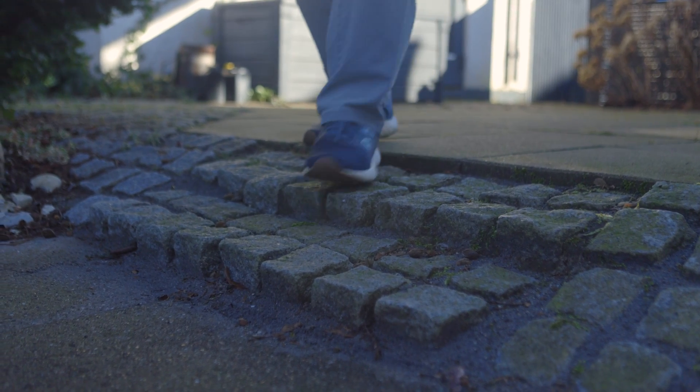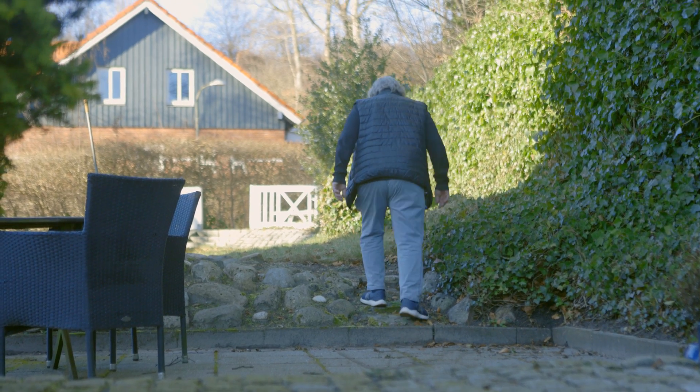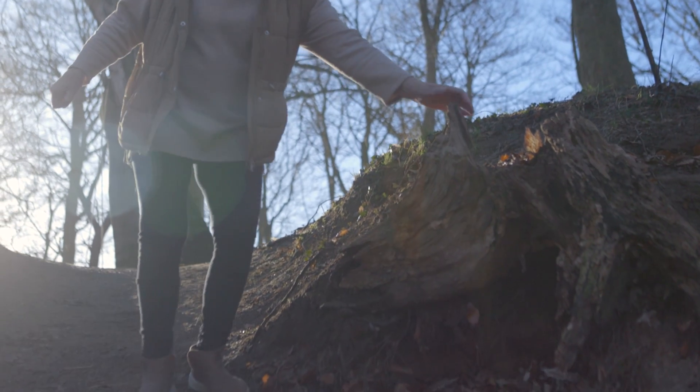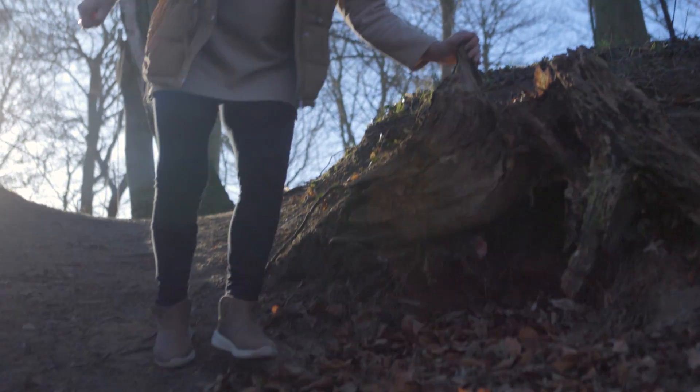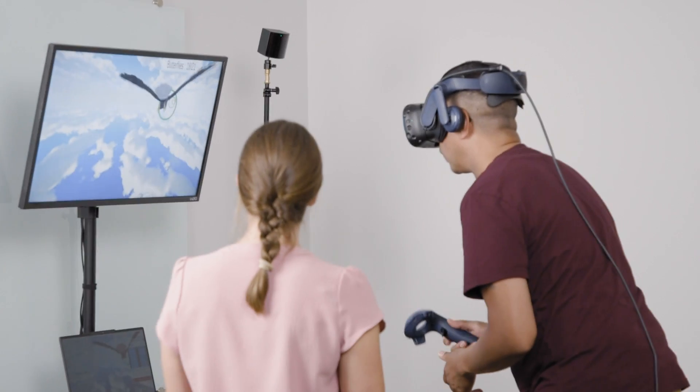People living with balance disorders are at an increased risk of falling and sustaining injuries. This can affect their confidence and quality of life.